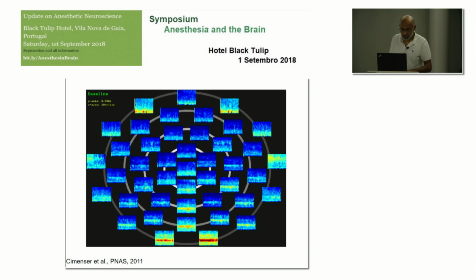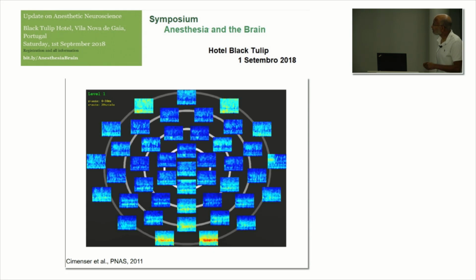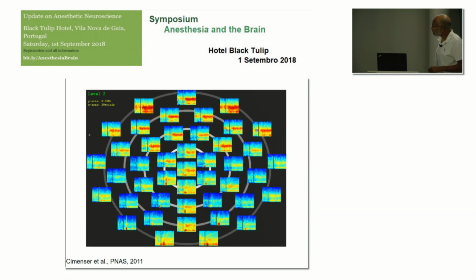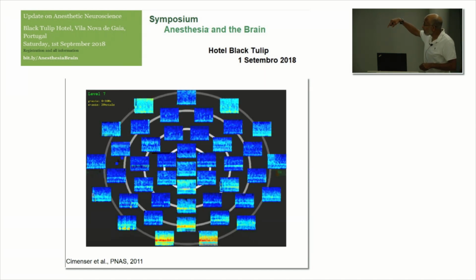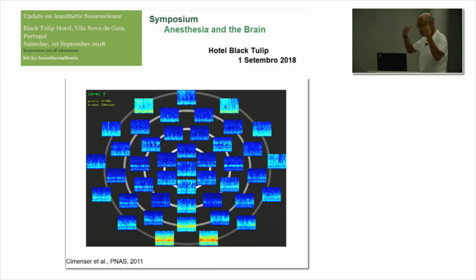So let me just play this for you, just to show you. So, no drug yet. Now you start administering the drug. Watch what happens. This is a computer-controlled infusion, using the Schnider model. You see how this disappears here, and it concentrates in the front. And back here, you just have slow oscillations. Then when you get to level 5, that's the deepest level. Now, when you turn the propofol off and let the person recover, the alpha oscillations move to the back again. So it does this.